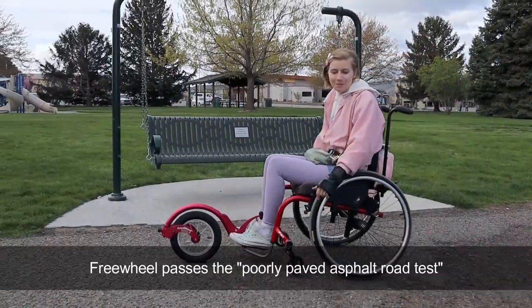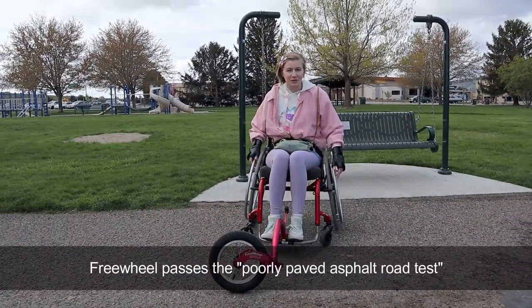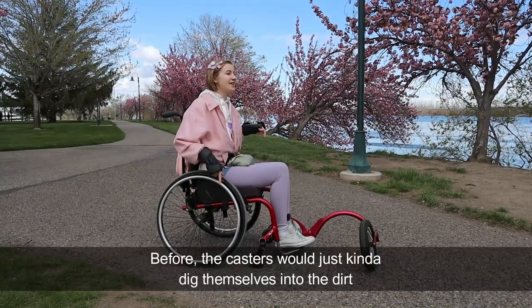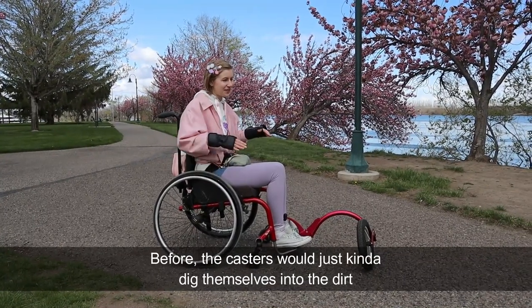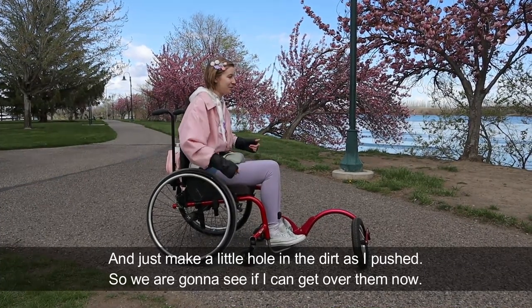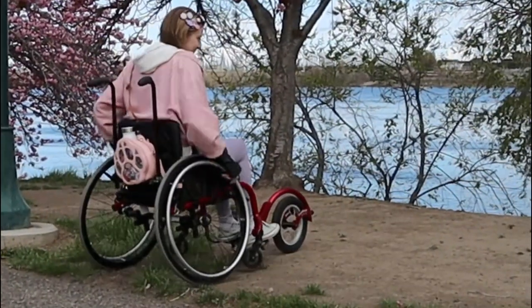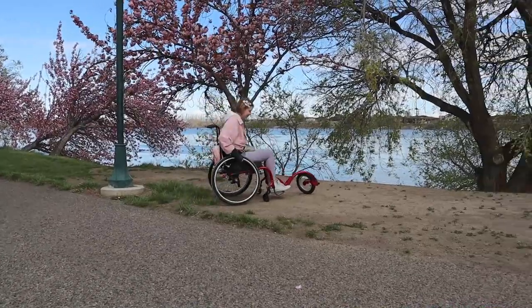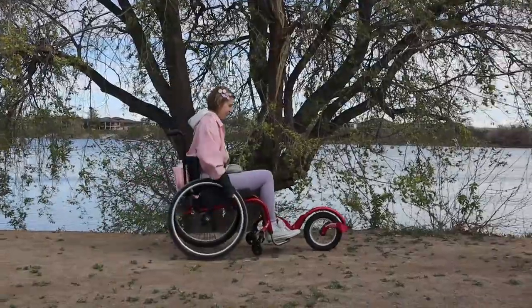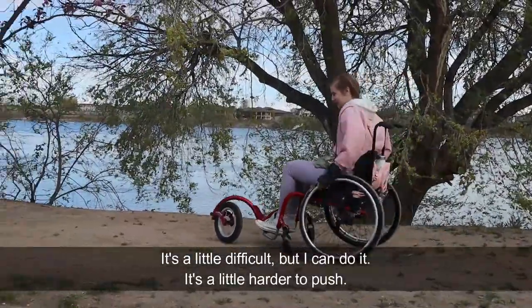Freewheel passes the poorly paved asphalt road test! Okay, next we're going to try dirt. Before, the casters would just kind of dig themselves into the dirt and just make a little hole as I pushed. So we're going to see if I can get over them now. It's a little difficult, but I can do it. It's a little harder to push.